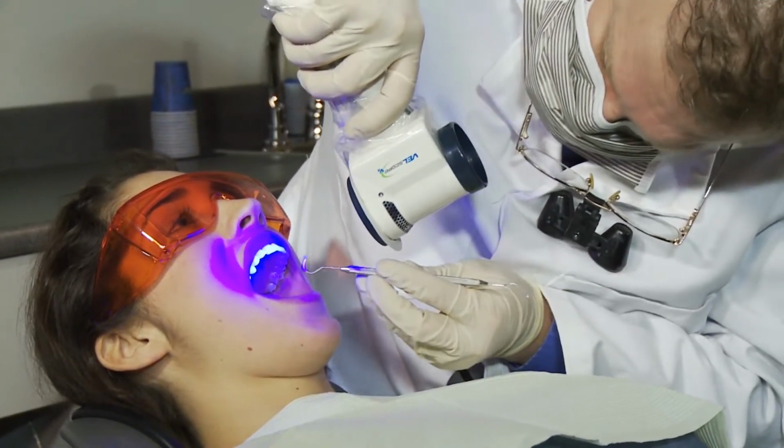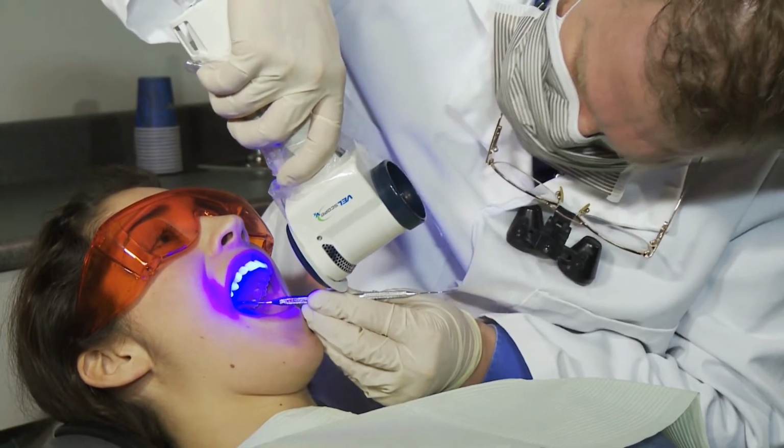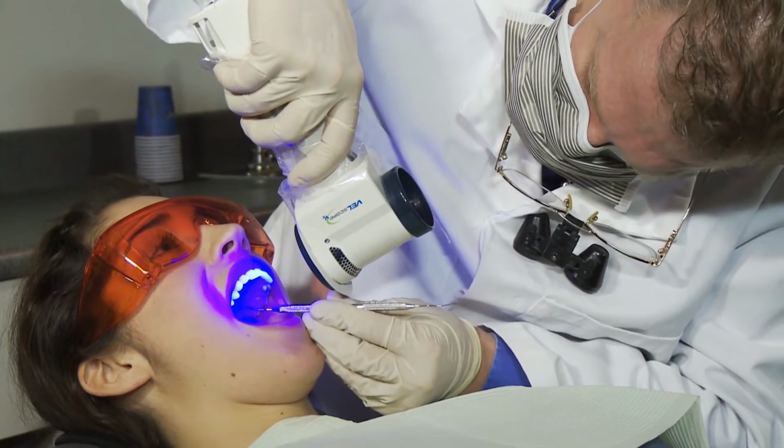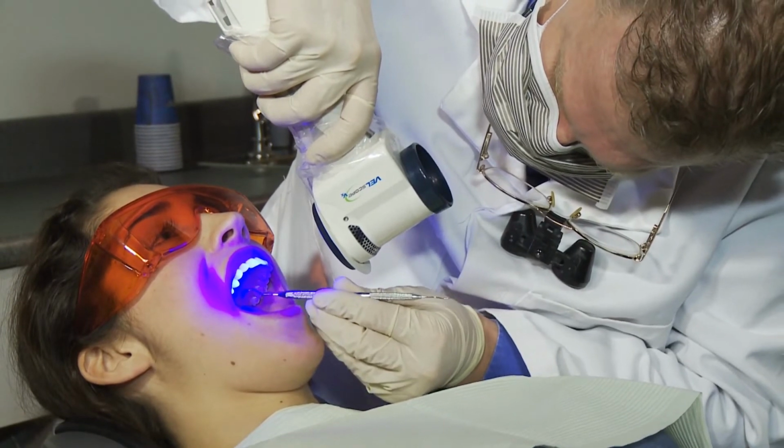If after re-examination the cause of the lesion cannot be identified, observe the suspicious tissue through the VELscope handpiece while applying diascopic pressure. This is often referred to as blanching. Compress the lesion using a light amount of pressure in a sweeping motion with the back side of an explorer, dental mirror, flat instrument, or your finger.